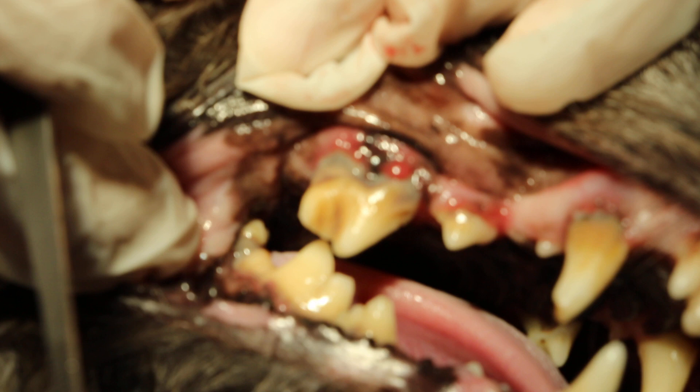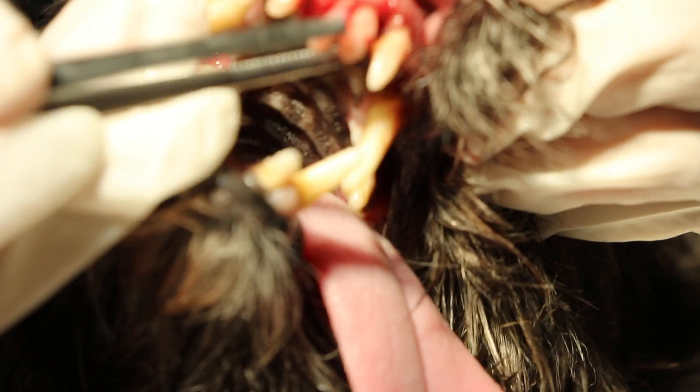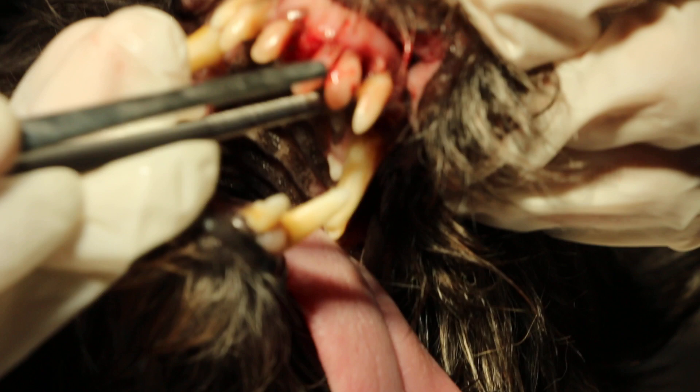And in the front teeth, the incisor, you can see the teeth are loose — in fact, it's shaky. This is where the food gets stuck and tartar accumulates. So that one will be of no use to the dog, so we will extract it.